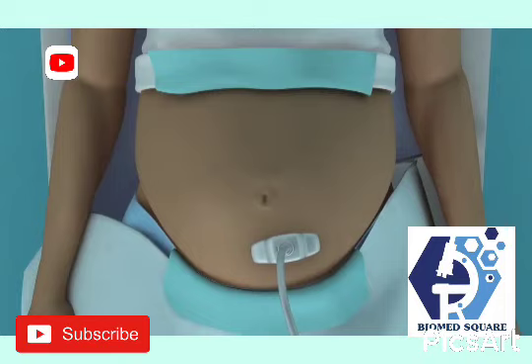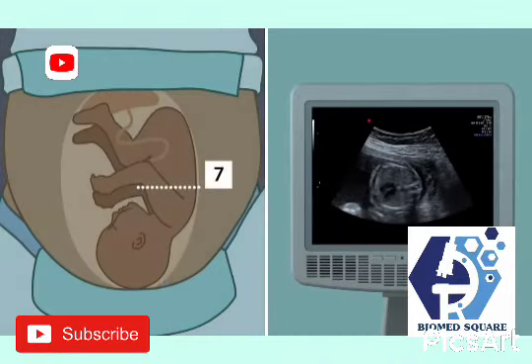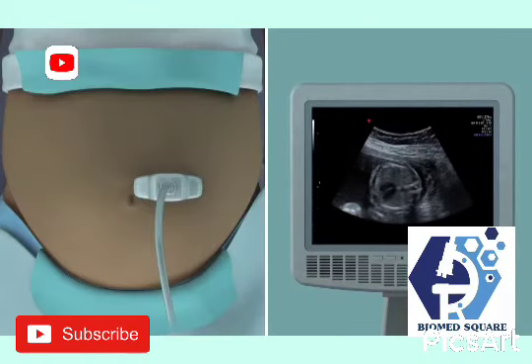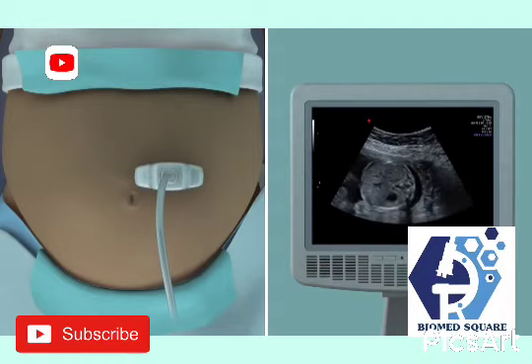Rotate back to the transventricular plane and slide the probe down through the chest where you will observe the heart beating. This is plane 7. To obtain the correct section to measure the abdominal circumference, or AC, you may need to make small rotating and angling movements of the probe as you slide. This will allow you to maintain a transverse orientation of the fetus.